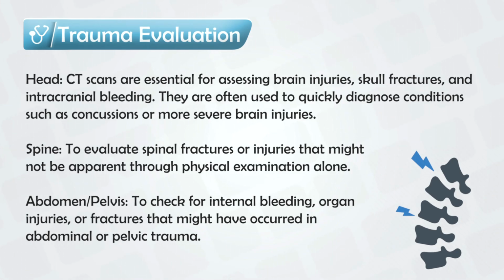CT brain is best used if the patient has some history of falling on the head or head trauma and they experience loss of consciousness, or a lucid interval, which is basically losing consciousness, regaining consciousness, and then losing it again. And this indicates intracranial hemorrhage.